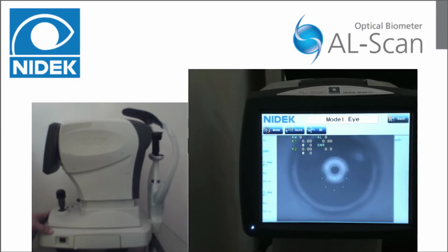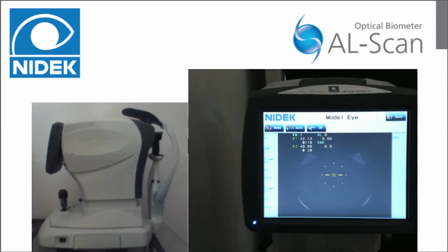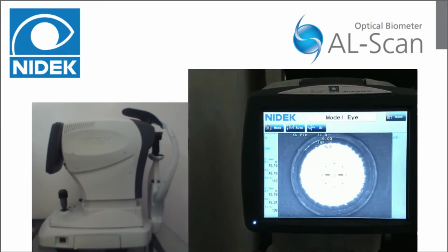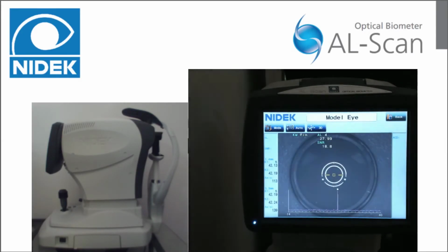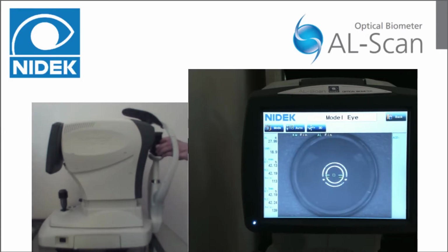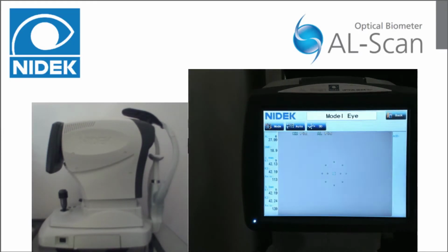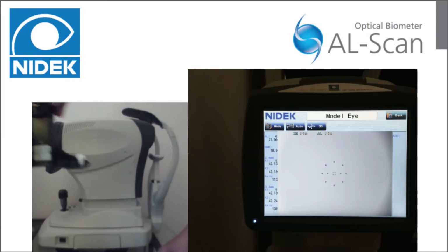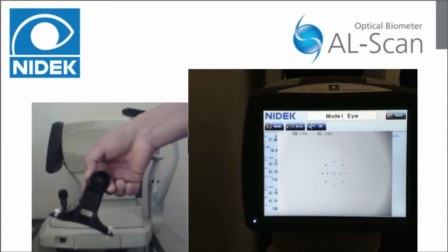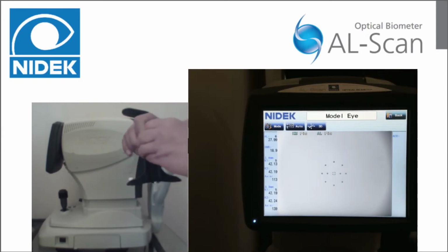Press the Model Eye button on the window displayed at startup. Align the Model Eye and push towards until auto alignment takes control. Once complete, confirm the measured values are within the range indicated on the sticker. If they are not within the range indicated, please contact our technical support at 1-800-223-9044, extension 2. Remove the Model Eye from the chin rest and replace the cap.